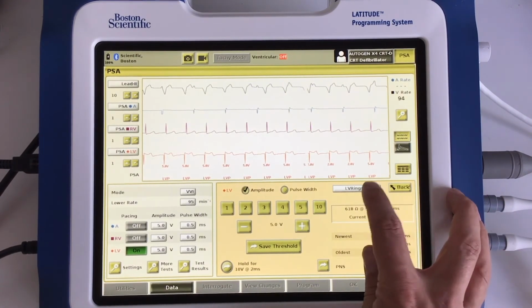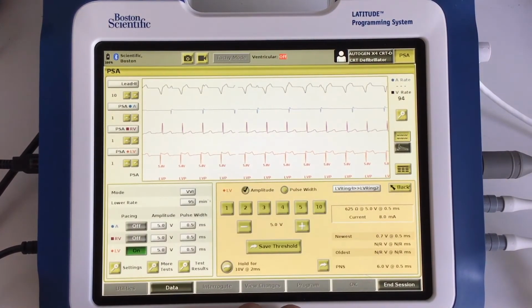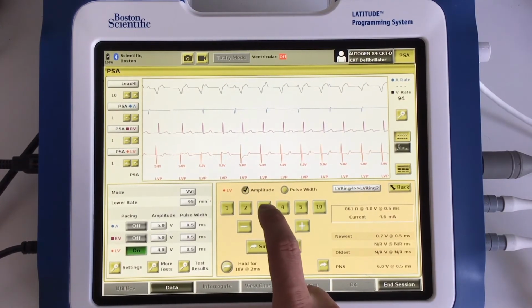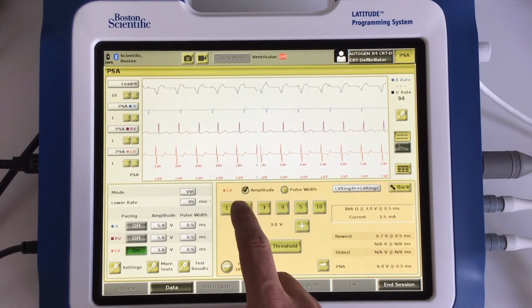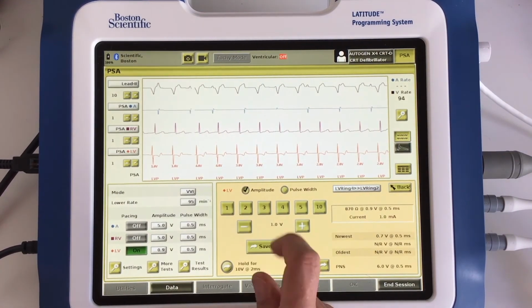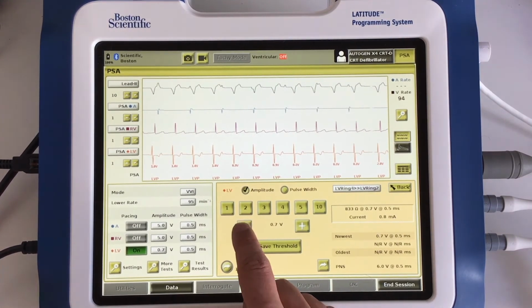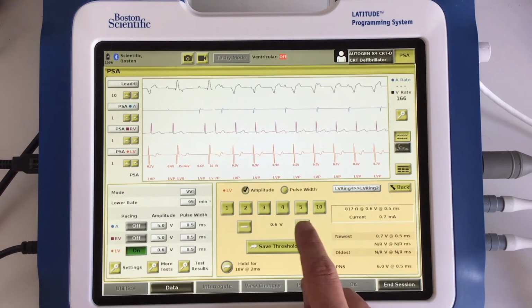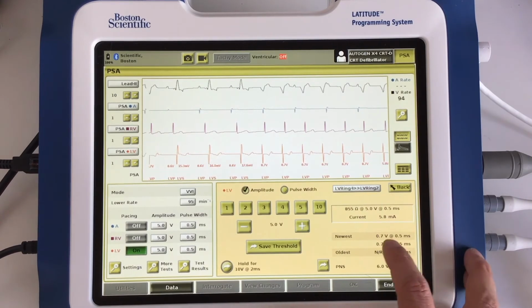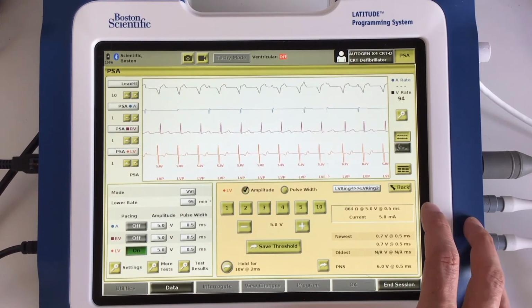So what other options do we have for the 4th electrode? Let's try 4 to 2. So we're currently pacing at 5, so we'll come down from here. This is looking good. Oh, much better. So come down from 1. Okay, so threshold of 0.7 at 0.5, and that's using 4 to 2. So we've got a good impedance and no twitching at 10.